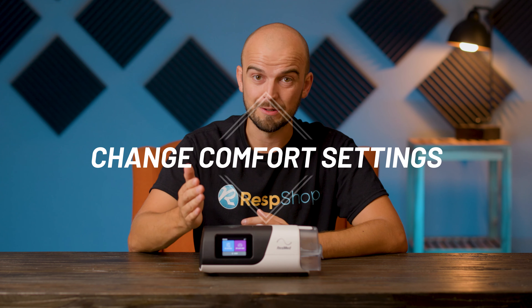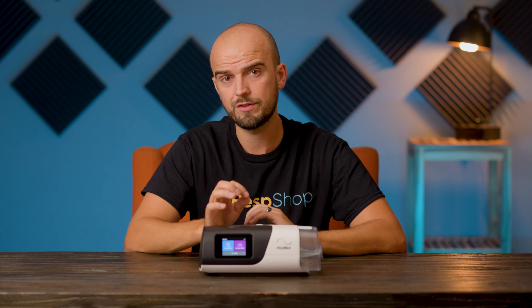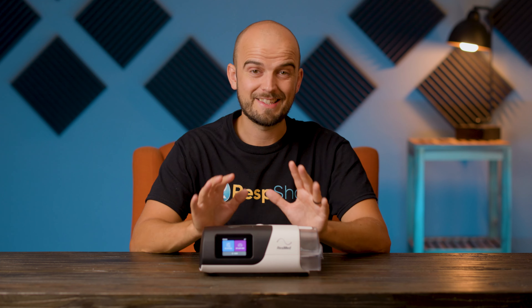Let's have a look at the menu. If the menu screen is dark, just tap on it to wake it up. The AirSense 11 has a light sensor, so the brightness of the screen will react to the ambient light, meaning it won't light up as much during those all-important dark hours. Once your screen is active, there will be three options on the display: My Options, My Sleep View, and More. My Options is where the bulk of the settings can be changed, but the only ones you can adjust from here are those related to your comfort, not your therapy as prescribed by your doctor. So changing these is all about finding what works best for you, and you should feel free to experiment. That said, if this is your first time using a CPAP, we recommend keeping these settings in auto mode, at least until you get more used to them.